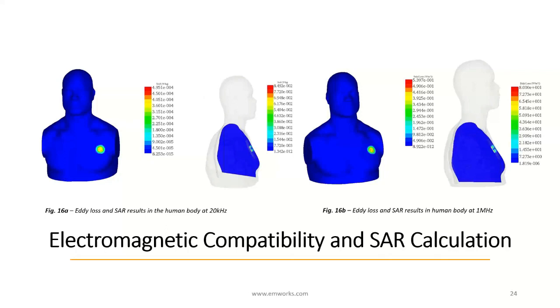Eddy losses density generated in the human tissue reaches a value of 0.5 watt per kilogram in case of 20 kHz, while it is much higher when the frequency is 1 MHz. Eddy current is proportional to the frequency and also the electrical conductivity, which also increases with the frequency. The calculated SAR values show a higher rate when the frequency is 1 MHz, while it is small when operating at a frequency of 20 kHz. This gives us an idea about the SAR and the limits of this quantity.